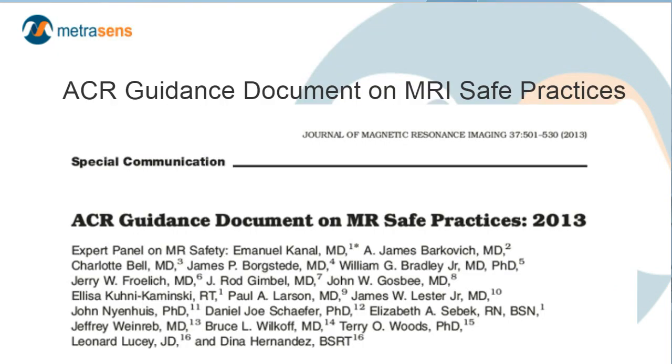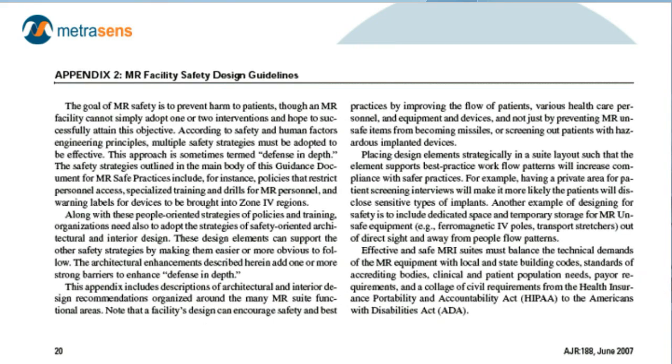I also made reference to the ACR guidance document on safe MR practices. 2013 is the most current full edition. There's a 2019 document that identifies some updates that will be part of a new fully re-released version of the document. But from a designer standpoint, let's stick with the 2013, both because it's a full and complete document, but also because it has the appendix that I also mentioned. That is Appendix 2, which, if you're a designer, the title of this should be, smack you in the head, straightforward.